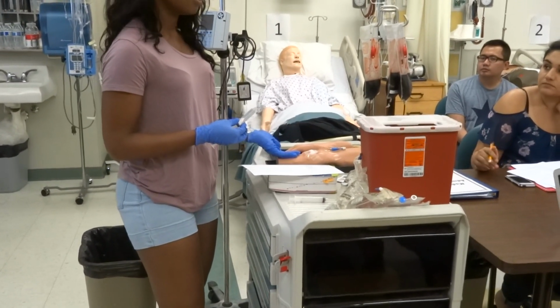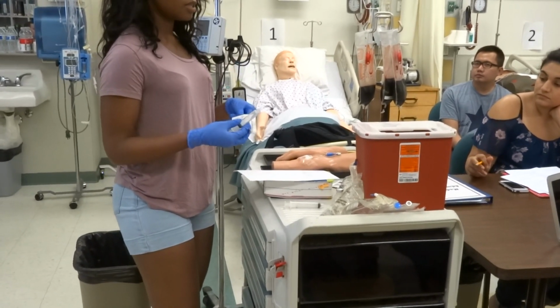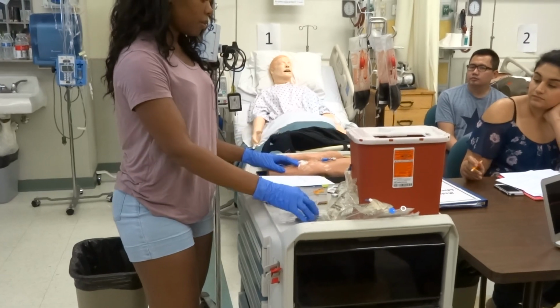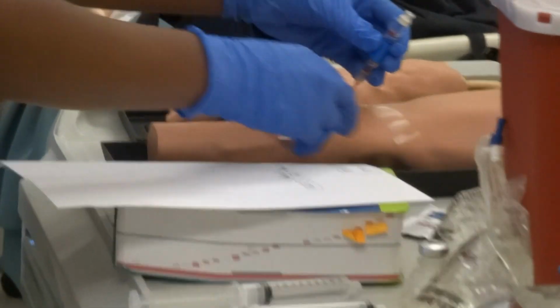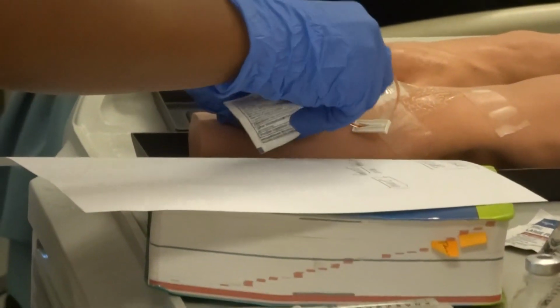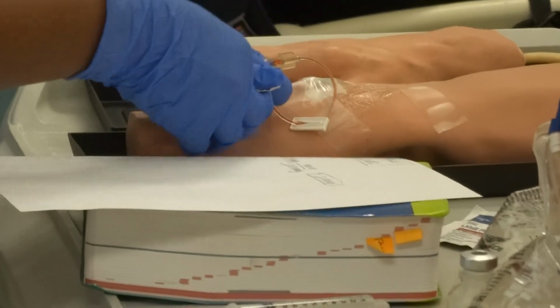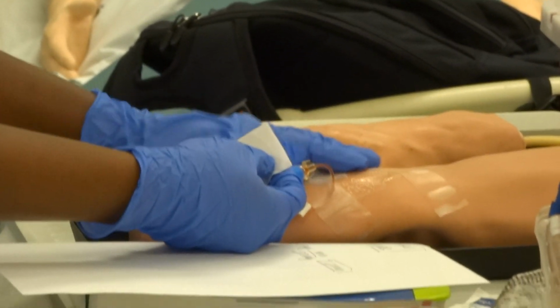Okay, I've identified them. Next, I'm going to scan in my medication. That's Lasix. Then I'm going to come back to the patient and make sure that their IV is patent, because if the IV is no good, then I would need to start another one. So I'm just letting the patient know what I'm going to do.